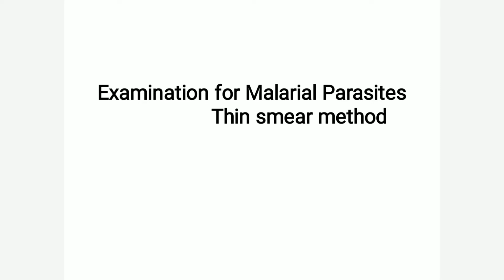The morphological diagnosis of the parasite consists of two steps: detection of the parasite or its parts in clinical samples, and its identification. Detection depends on collection of the appropriate samples and their examination by suitable techniques, whereas identification requires adequate skill and expertise in recognizing the parasite in its various stages and differentiating it from morphologically similar artifacts.